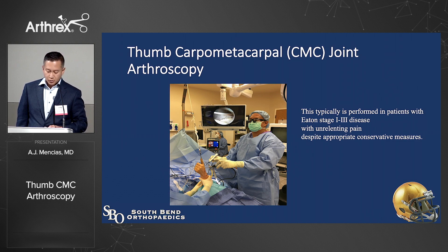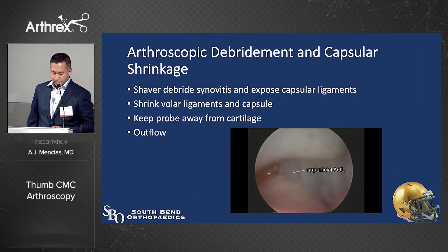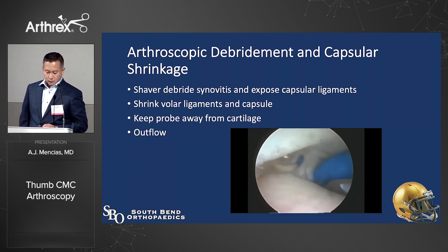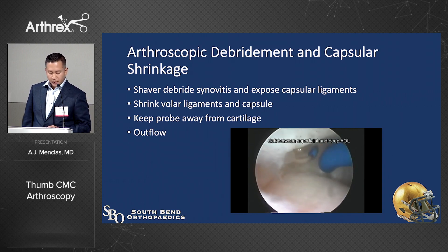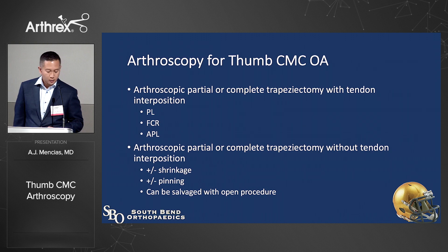Here you can see the burr aggressively taking away about three millimeters of the trapezium. This is me doing arthroscopy on the CMC joint — you can debride it, shrink the capsule, and shrink some of the ligaments. Keep the probe away from cartilage, and maintain outflow and inflow to keep the temperature within the joint. Here's a thermal wand shrinking the volar beak ligament and some of the volar capsule ligament structures. In patients with initial instability, grade one or grade two, this really does help.